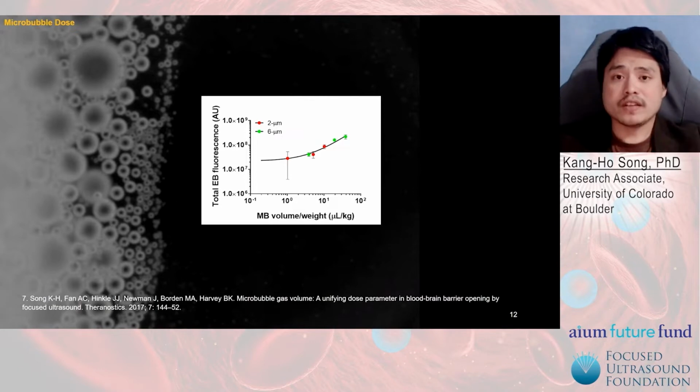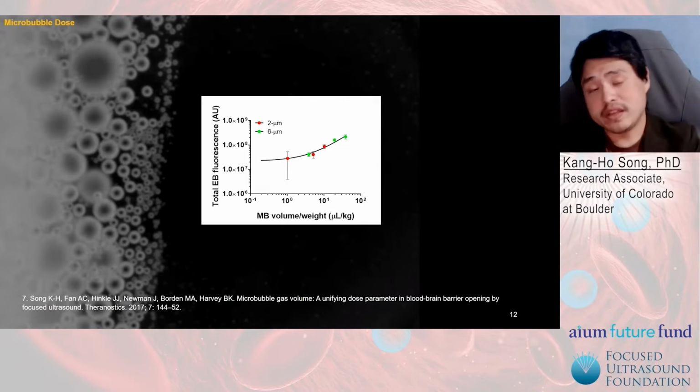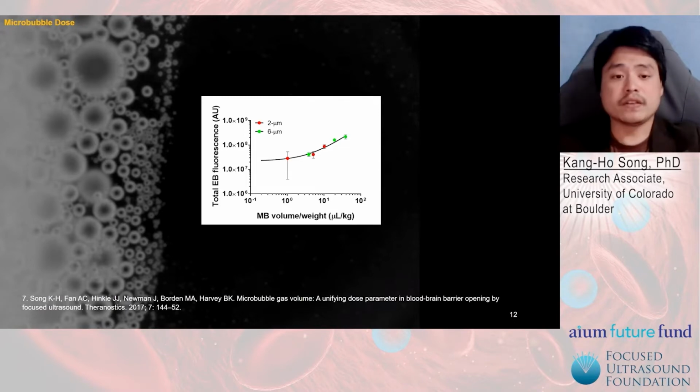But unfortunately, what we don't know is how these sizes might affect other bioeffects, such as neuroinflammation and microhemorrhaging. So these are all things to consider. And while more characterization may help us collapse more parameters and associate them with specific bioeffects, these are all challenges and cons to employing therapeutic microbubbles.